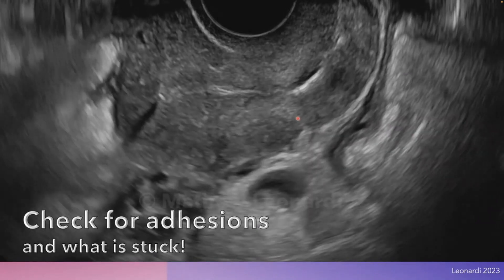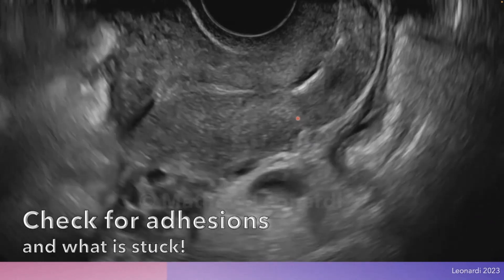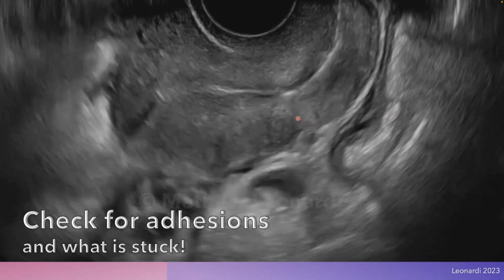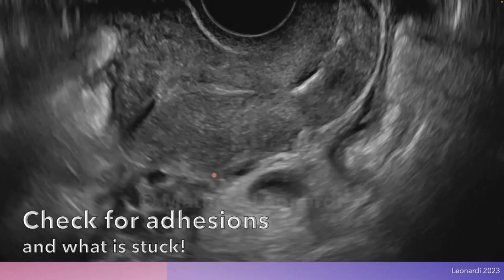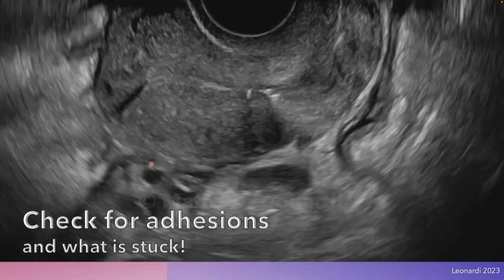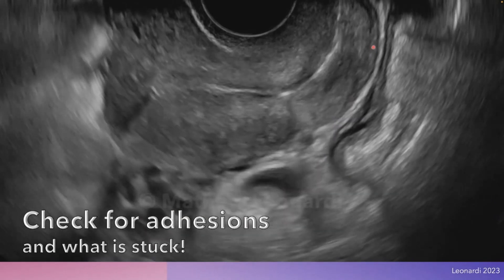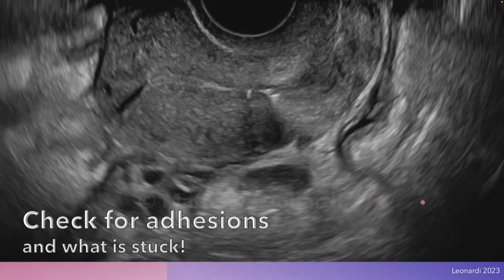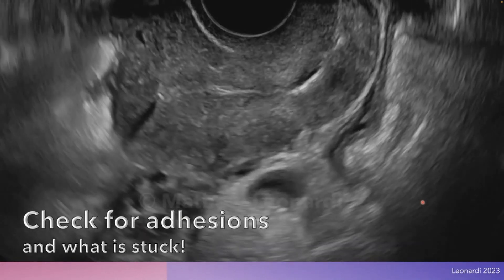Another important lesson is to always check for adhesions in the pelvis using dynamic techniques. Here we have a depiction of the sliding sign — in this case a negative sliding sign, an abnormal state. A negative sliding sign means there is no sliding between the posterior uterine serosa, retrocervix, and the bowel content behind it. We also have adhesions of this ovary to the posterior uterine serosa, and adhesions all along the entire surface. The non-scanning hand is balloting the uterus to facilitate movement. Assessing for adhesions helps us diagnose the disease and understand surgical complexity.